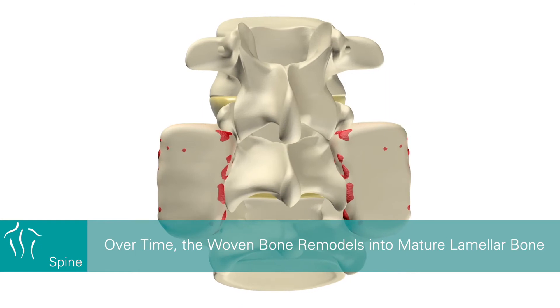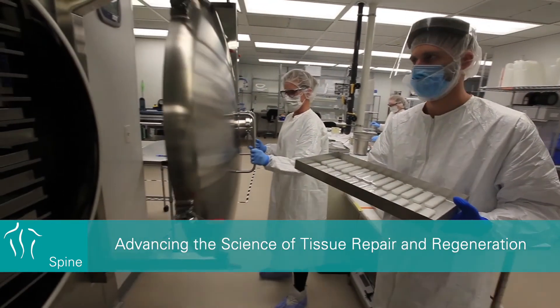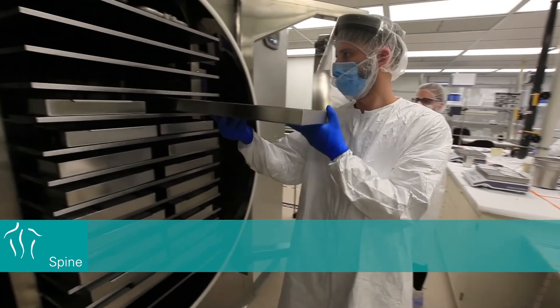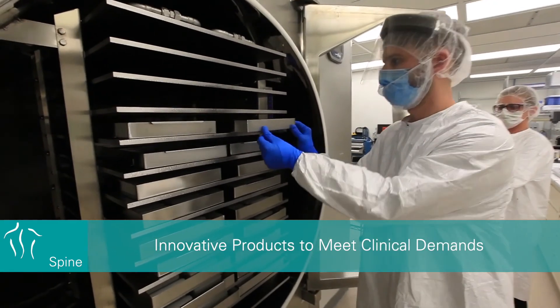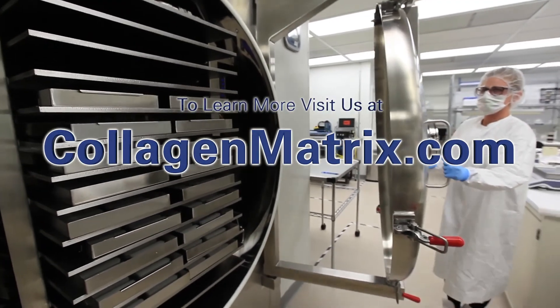The matrix attracts additional osteoblasts which facilitate mineralization by forming woven bone. Over time, the woven bone remodels into mature lamellar bone. Collagen Matrix is advancing the science of tissue repair and regeneration through the development of innovative products to meet clinical demands. To learn more, visit us at collagenmatrix.com.